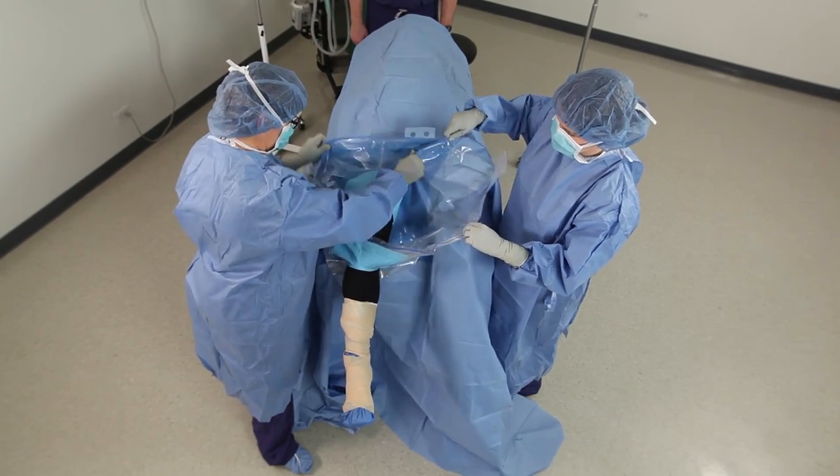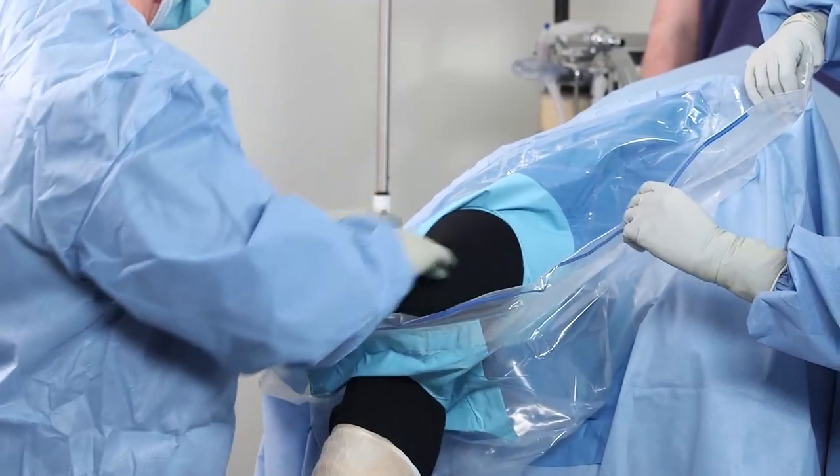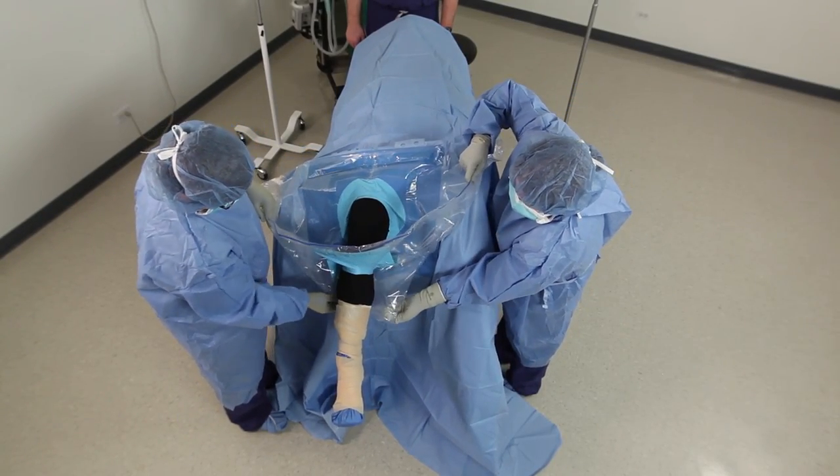The drape provides a large fluid collection pouch. It includes a port used to connect suction and tabs for holding cords.